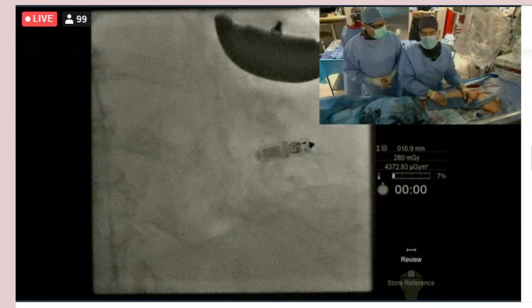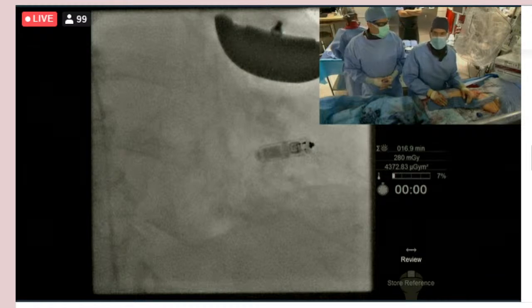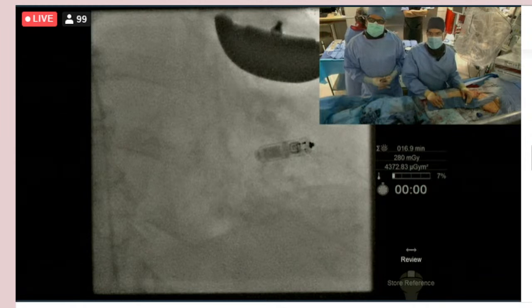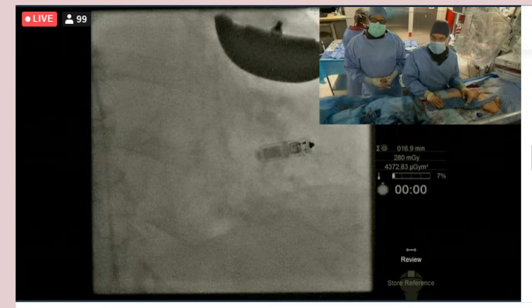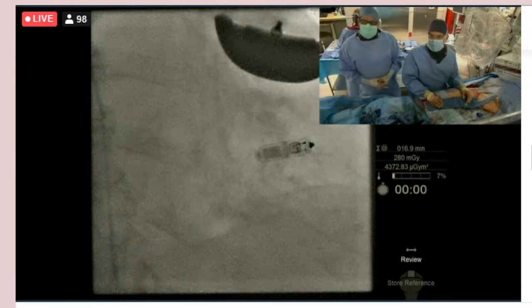ClearSight is a non-invasive blood pressure monitor that is real time. On the real-time screen, you see it reading 127/83. Maybe we can take a peek at that. Can you show us the screen? Essentially, it's a $250 finger cuff that is an arterial line. Can you see that? No, not yet.